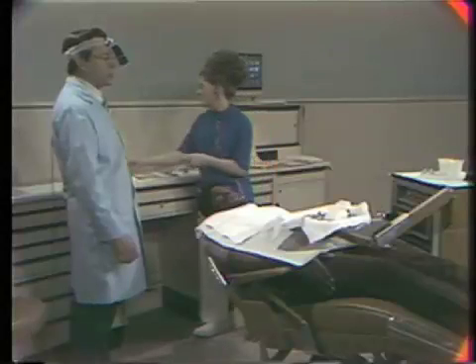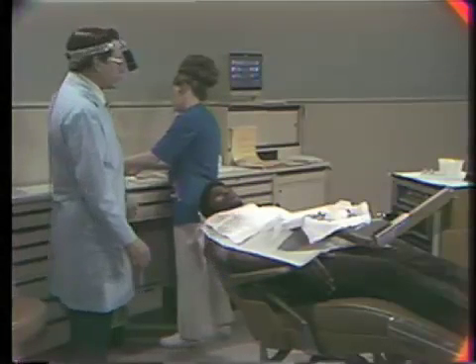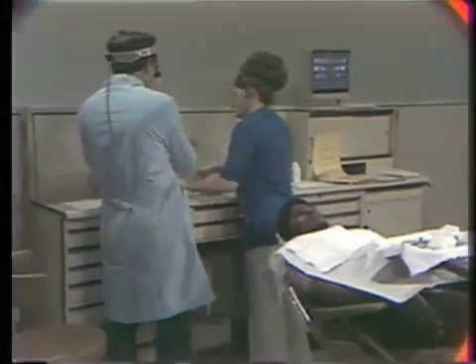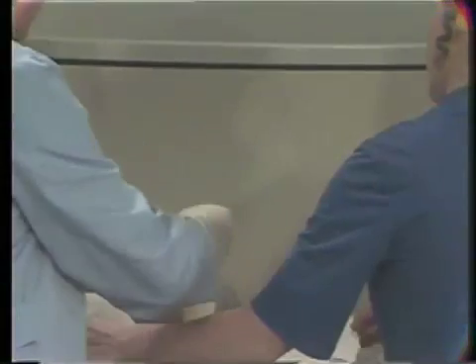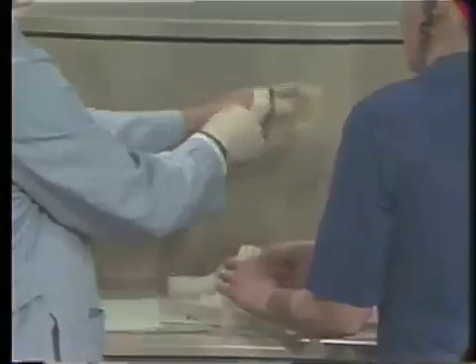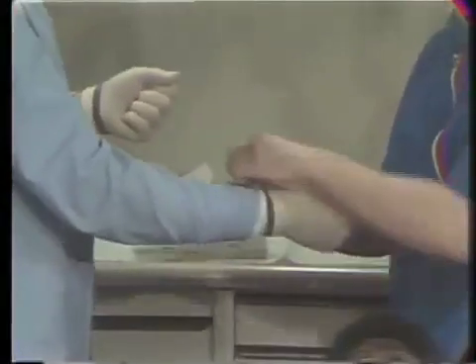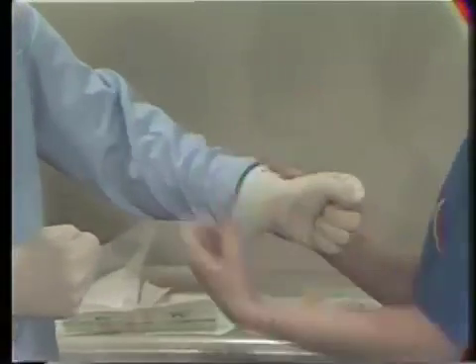When assisting, we are concerned with procedures that save minimal time as well as ones that save maximum amount of time, such as the placement of the rubber gloves on the operator's hands. These are sterile and were contained in a sterile package, and I place them on my hands, and then Mrs. French will put them up over my cuffs without touching them, so then I can immediately go into the patient's mouth and start the procedure.